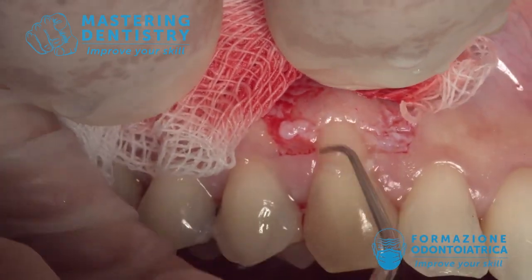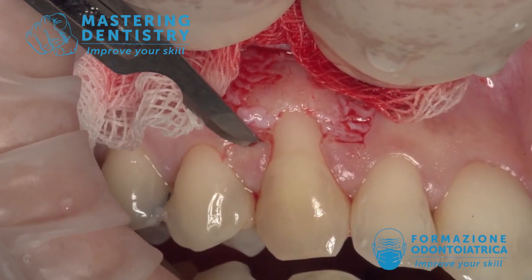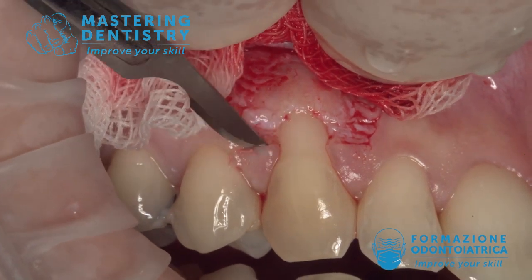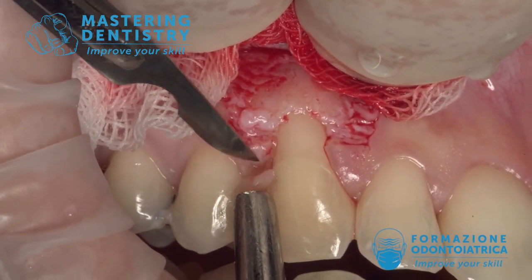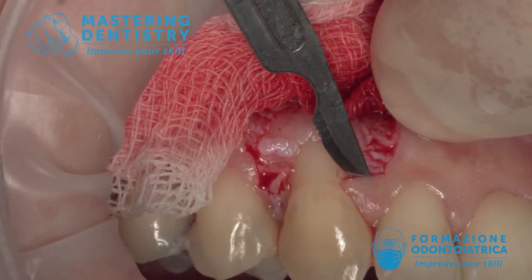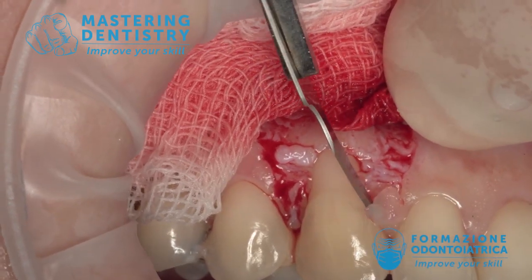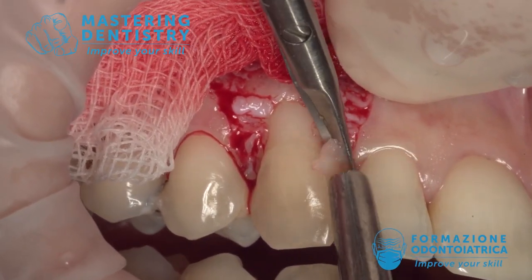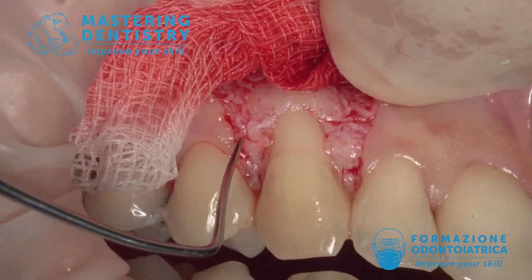Now a very gentle root planing. The next step is the de-epithelialization of the papilla: with the blade you start from the apical portion of the papilla and cut away a very slim, very thin layer of epithelium, finishing with the microsurgical scissors — scissors are useful because you need to reach all the way to the very tip of the papilla. All the old epithelium has been eliminated; the flap is partial thickness all around and full thickness only apical to the recession.